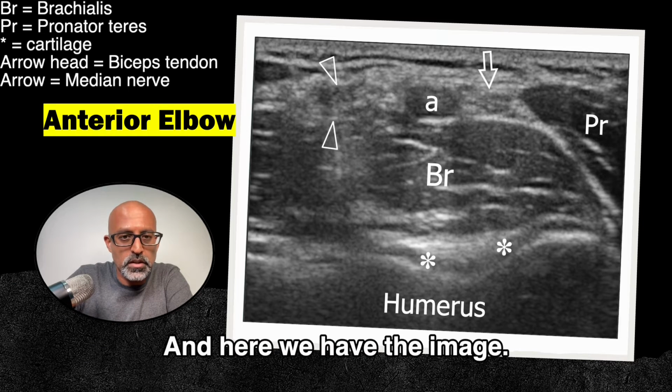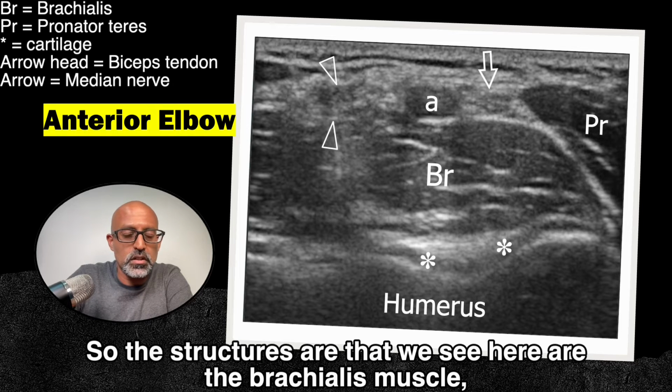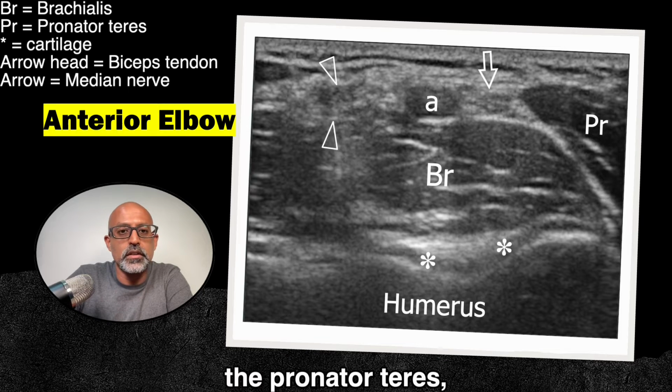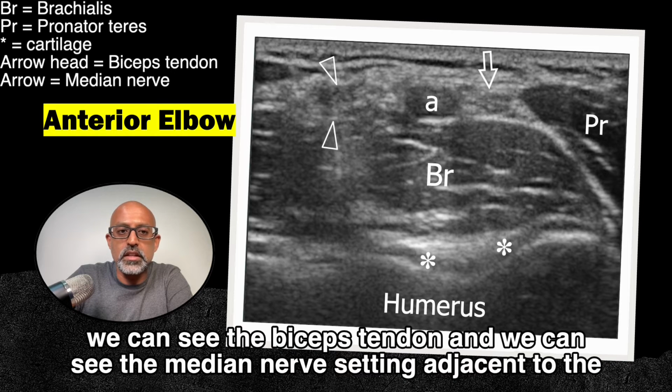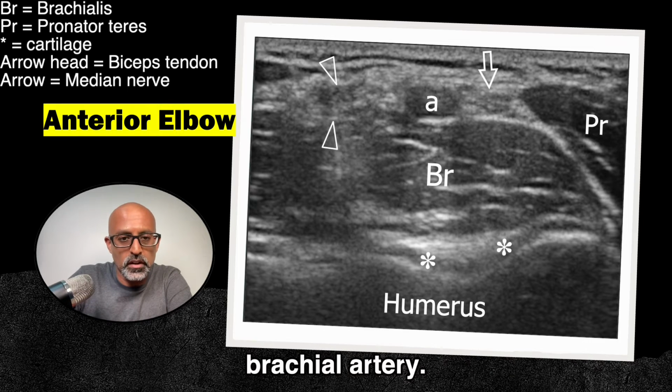And here we have the image. So the structures that we see here are the brachialis muscle, the pronator teres, the cartilage of the humerus. We can see the biceps tendon, and we can see the median nerve sitting adjacent to the brachial artery.